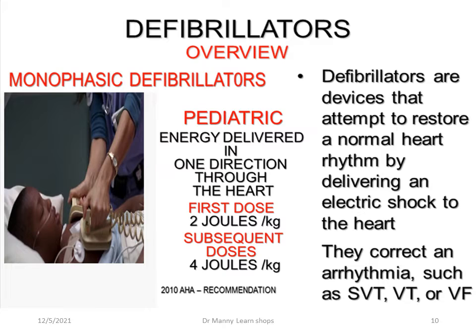Defibrillators essentially attempt to restore a normal heart rhythm by delivering an electrical shock to the heart. They correct arrhythmias such as supraventricular tachycardia, SVT, ventricular tachycardia, VT, or ventricular fibrillation, VF.